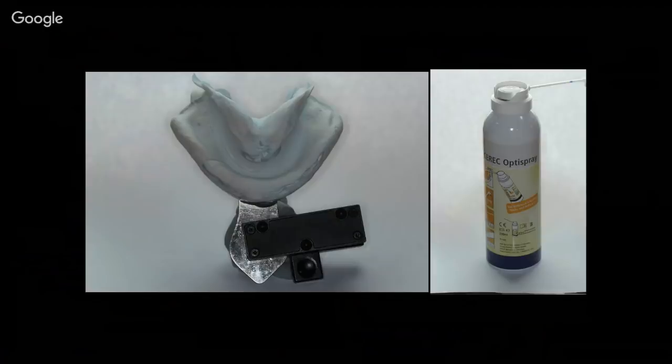I will tell you that I went back and I worked out the complete cost per denture, and on average, it costs about $8 or so to print a base out of that NextDent Base material, and then you're looking at $10 per arch to buy the anterior and posterior teeth if you're using those Nobilium teeth. So we were up around $16, $17 per arch for the completed denture. That's all in materials cost.